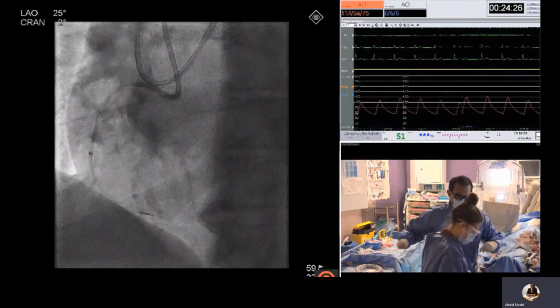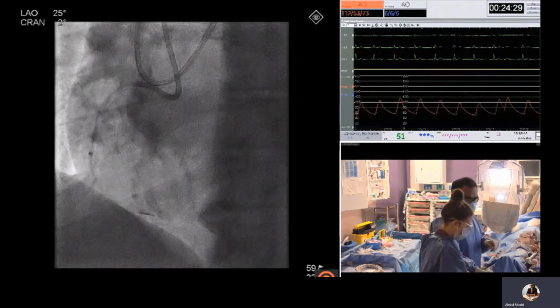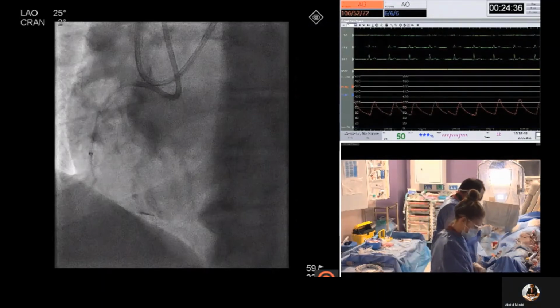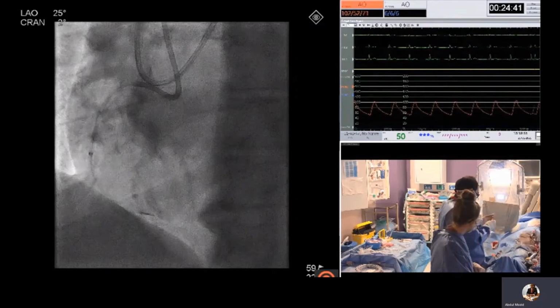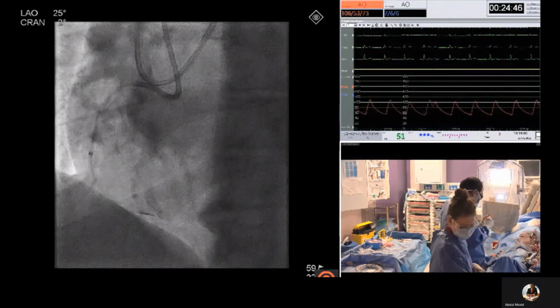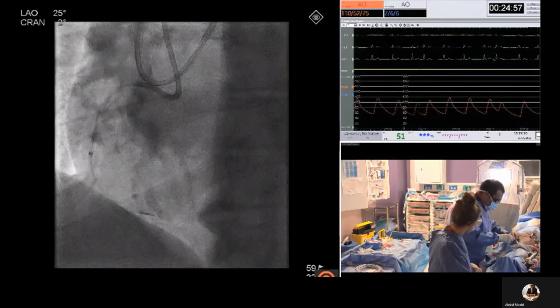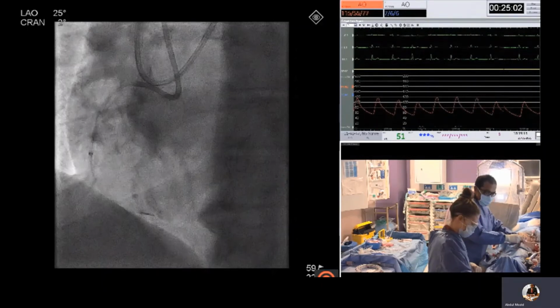I'm confident that the Stingray is actually below the vessel, having previously seen that the CrossBoss was below the vessel at this point also. So yeah. Now the aim is to puncture into the vessel, and I elected to use a Astato 20 wire here directly, given the calcification. So this is a 20-gram wire produced by Asahi.